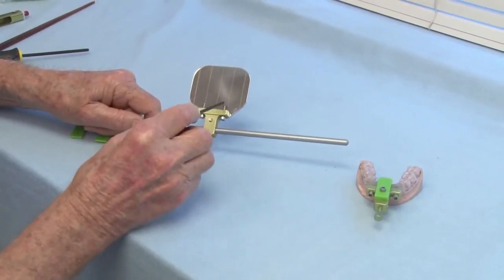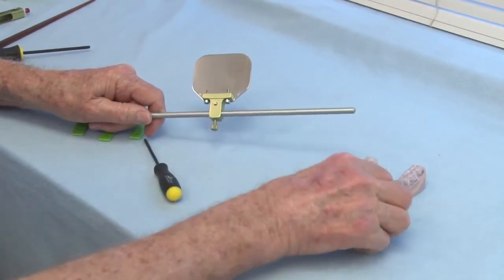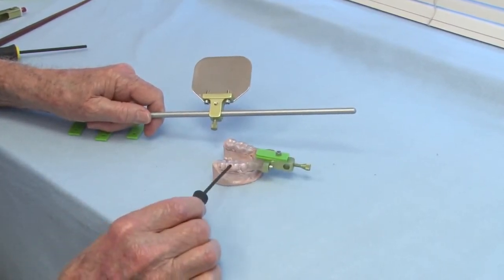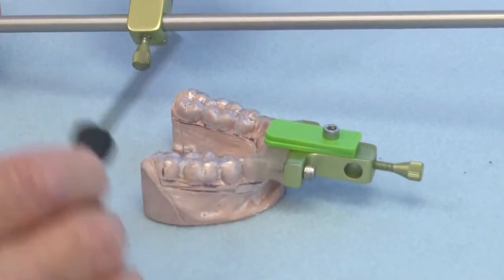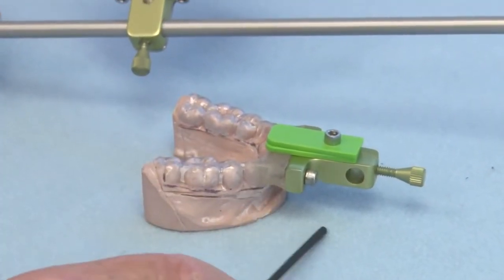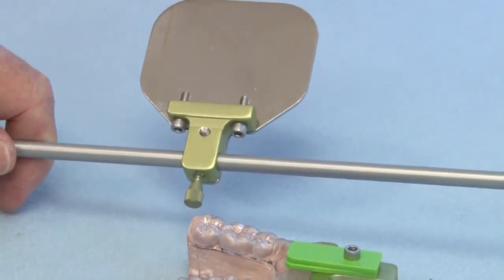Your patient model goes here, lower model of the teeth, and then you would adapt Biocryl to it. This is a finished product here. You can see the lower model with the Biocryl adapted, and then we use self-curing acrylic and adapt the clutch holder to the self-curing acrylic. And so this is a finished product ready to take off of the model, put on the patient's teeth.